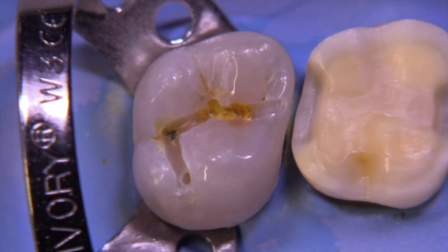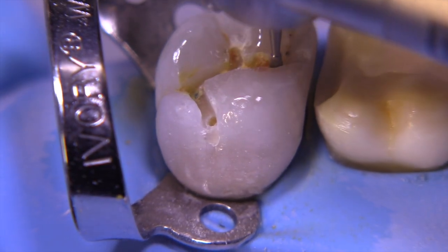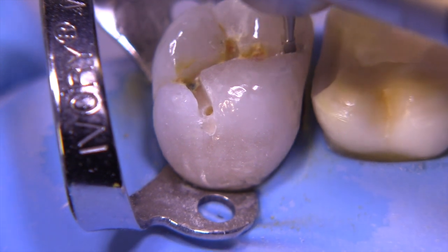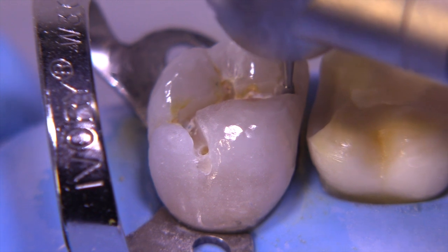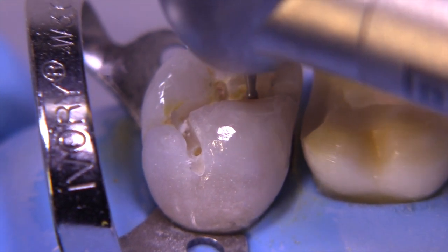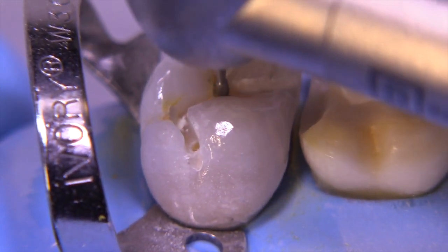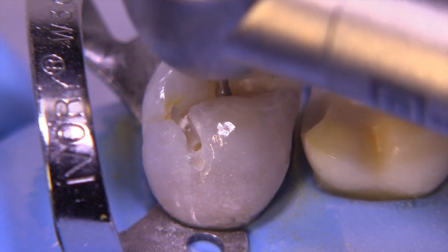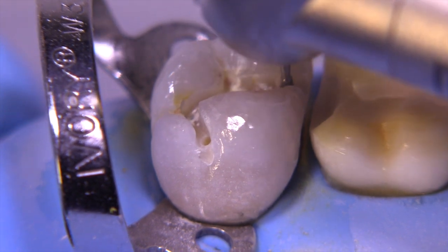There's a lot of caries here so this is going to extend quite a bit more, and you're going to see that the mesial lingual cusp particularly is quite undermined. I'm continuing with the 330 burr, going all the way out to the mesial because we know we're going to be dropping a box due to caries in that location. Typically you would prepare both teeth at the same time and drop both boxes simultaneously.